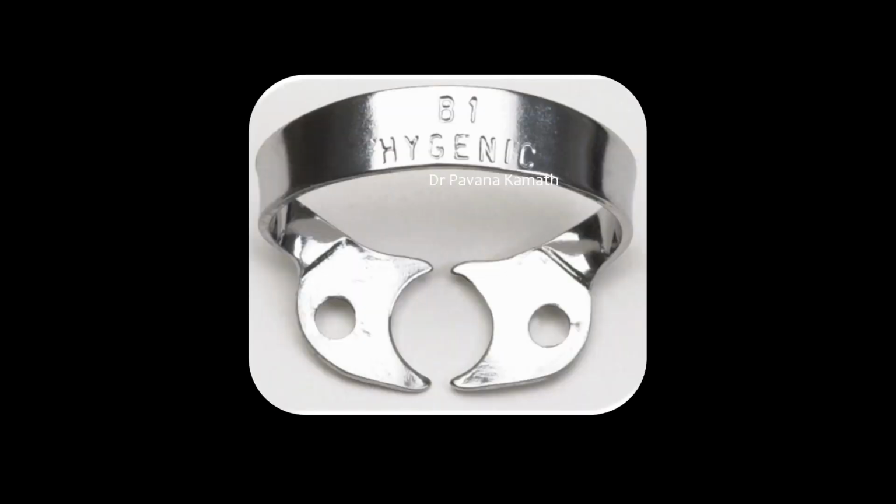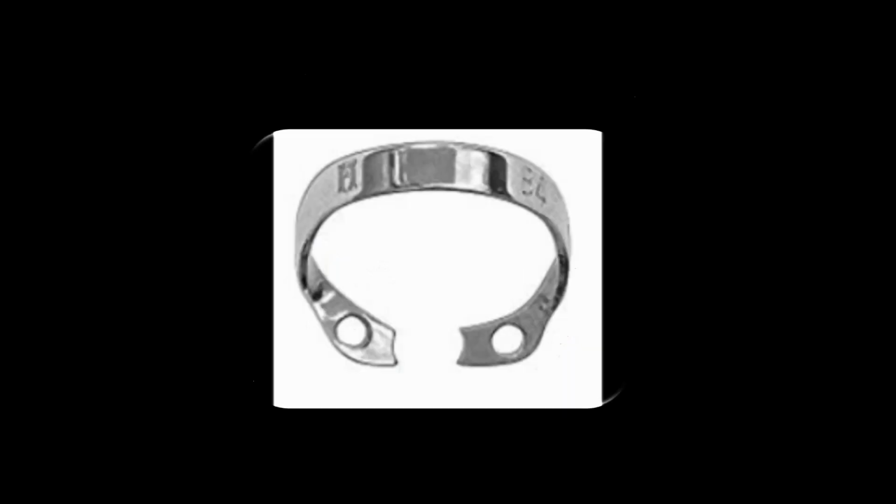The first one is the B1. The B1 is excellent for isolation for lower mandibular molars, that is the deciduous molars, which are small, and because they are tissue retractors, they will not put too much pressure on the gingiva, and hence the children are very cooperative. What else do we have?